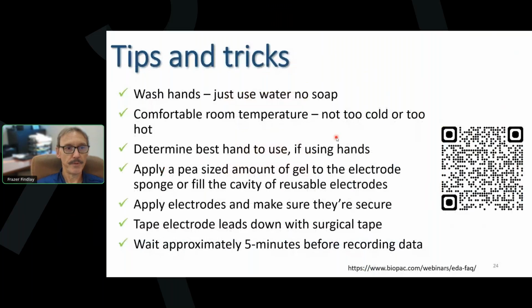I put a few tips down here. We also have an FAQ on the website as well. The QR code will take you to that. But essentially, wash the hands. You don't need soap, just plain water, dry them off, make sure they're thoroughly dry. Make sure your room environment, the temperature, is not too hot, not too cold. You kind of need the Goldilocks approach.